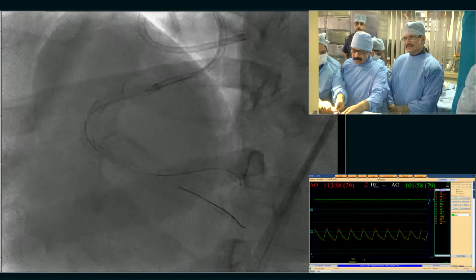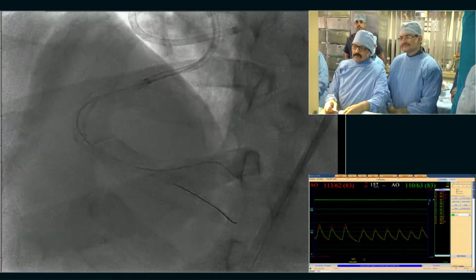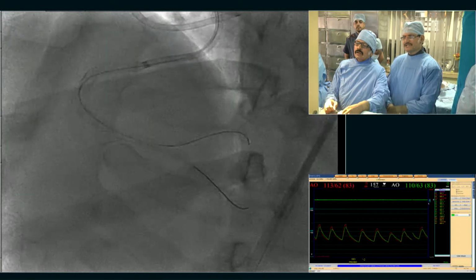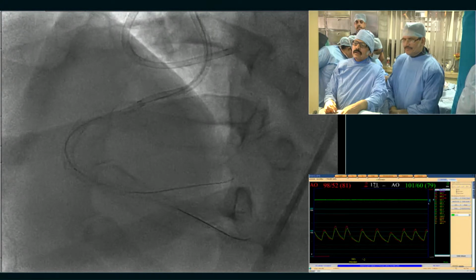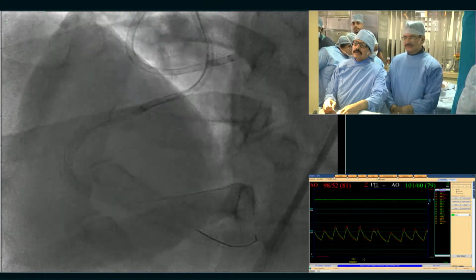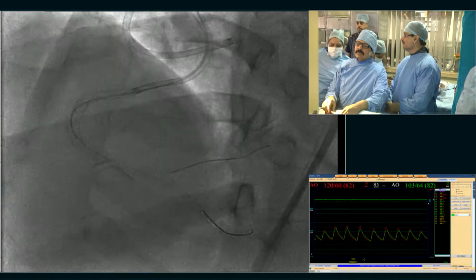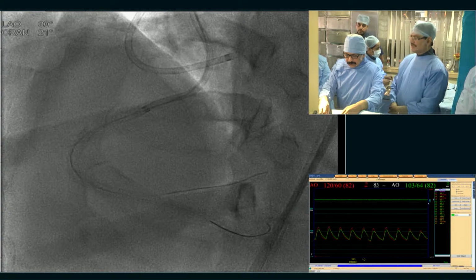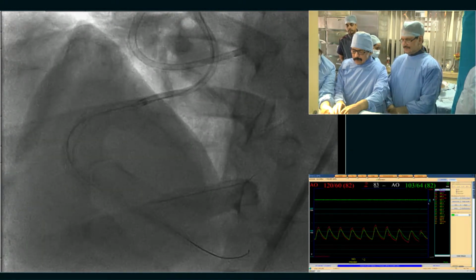First dilate the PLV. So now you plan to use a balloon. Yeah, balloon dilatation for PLV ostium. Which one? What is the balloon? Take 1.25. This is a 1.5 mm balloon. Yes, you can take.